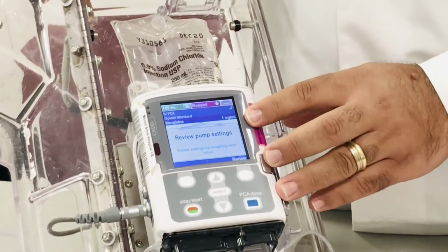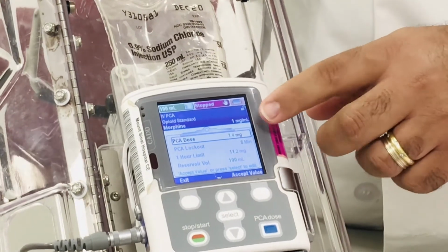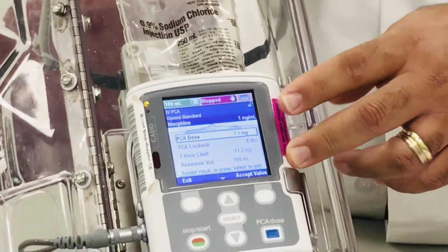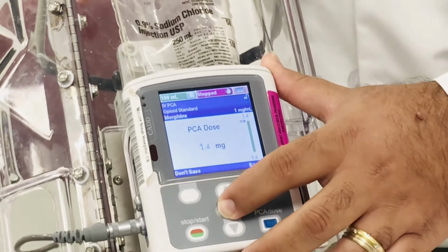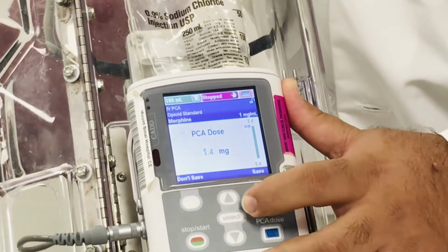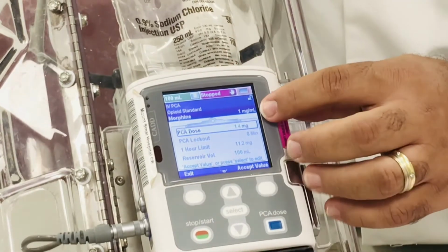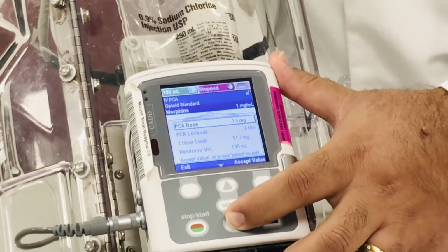It's going to ask you to review the settings of the pump. When you click review, the PCA dose, every time they press the button, they're going to get 1.4 milligrams in this case. If your order is different, you're going to select that, and then you're able to change the standard dosage. In this case, we are not going to save it because it is the correct order. It's 1.4 milligrams every time you press it.